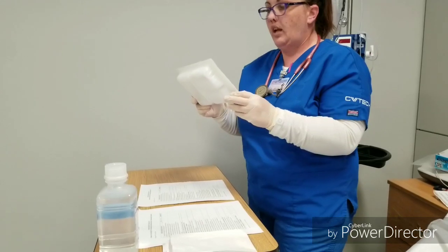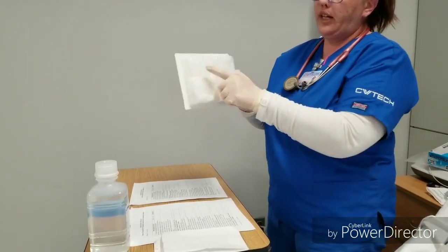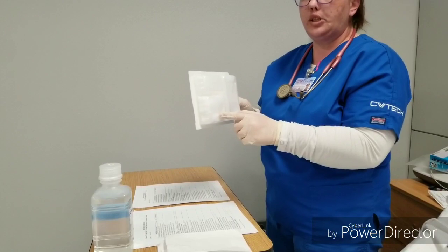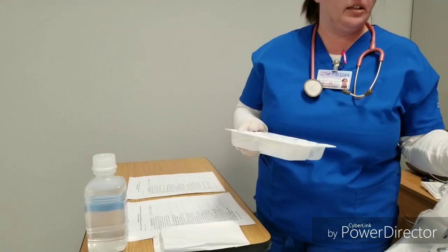This is your trach care kit, and it will have 3 compartments, and you're going to use the first compartment filled with hydrogen peroxide and the next 2 with saline. And we're going to be cleaning the inner cannula of the trach.